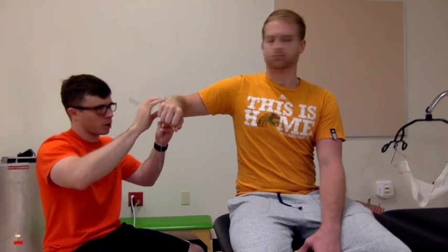For internal rotation, the axis goes on the olecranon process of the elbow, the movable arm parallel to the ulna, and the stationary arm is going to be parallel with the trunk. Go ahead and perform the motion for me. Okay, looking at right around 72 degrees.